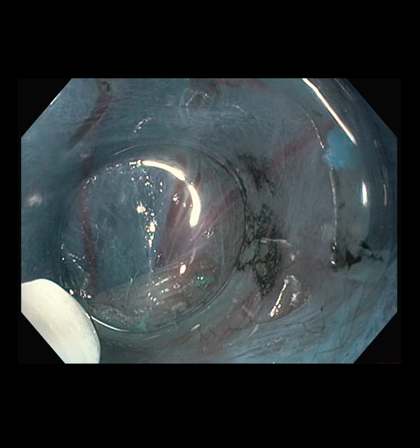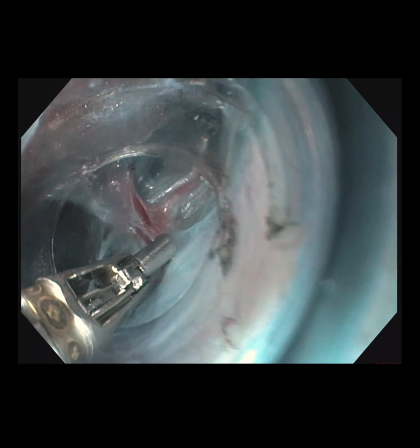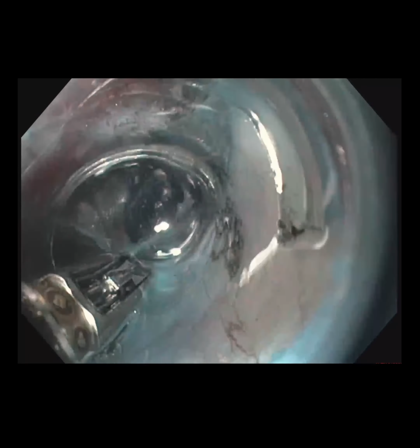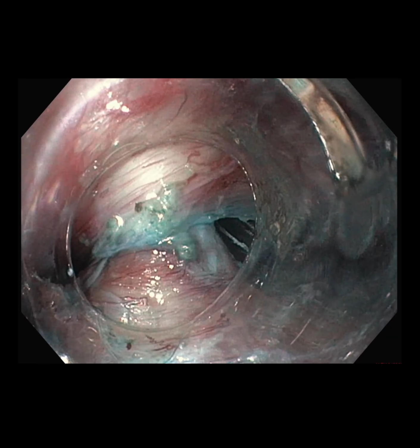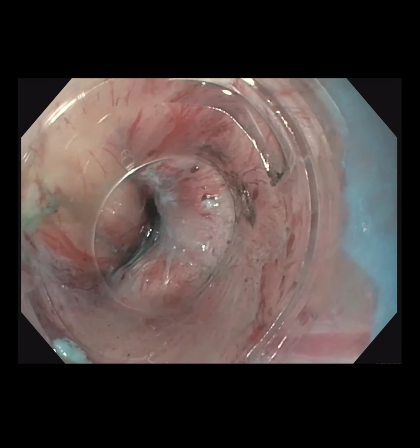We also encountered multiple large collaterals. There was a particularly large collateral sitting on the septum of the diverticulum, so it was carefully isolated and coagulated with the help of coagrasper forceps. Dissections on both sides of the septum were completed and we could isolate a thick septum in between.